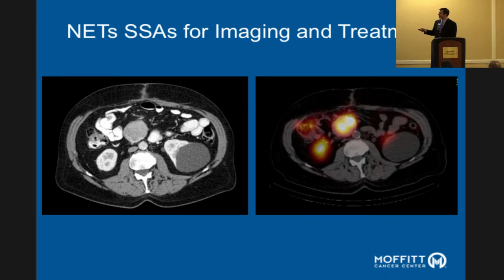You get this big lymph node mass in the mesentery. So this is kind of easy. You don't need an octreoscan to find this. You should be able to see this without an octreoscan. What the octreoscan does here is, this is a CT image, and the nuclear medicine data is this stuff in color, and the CT image is just the same kind of technology.